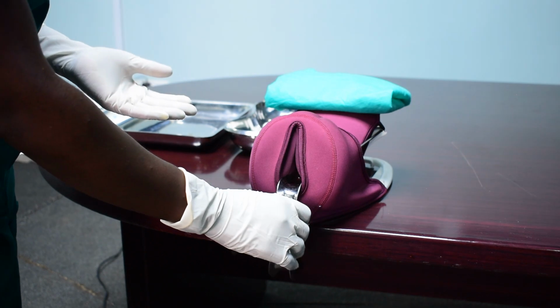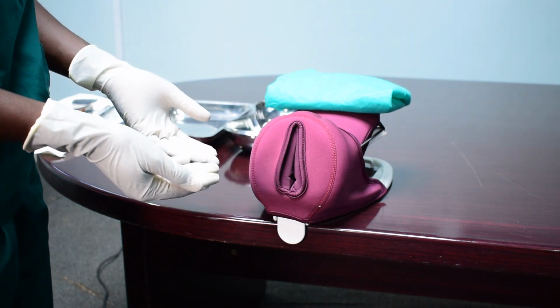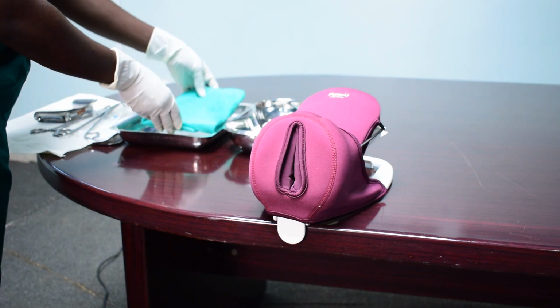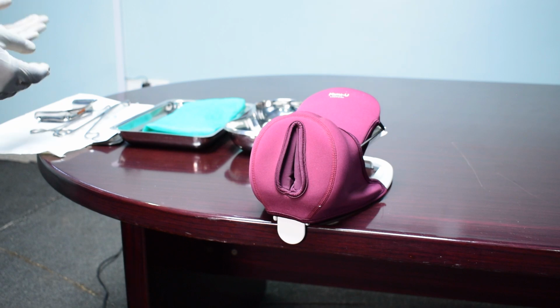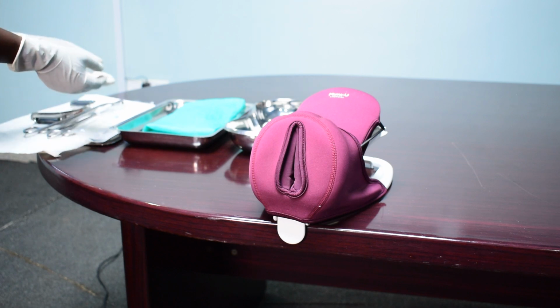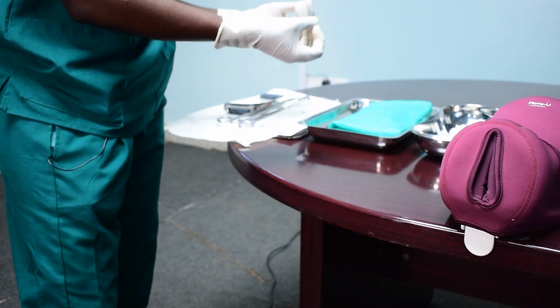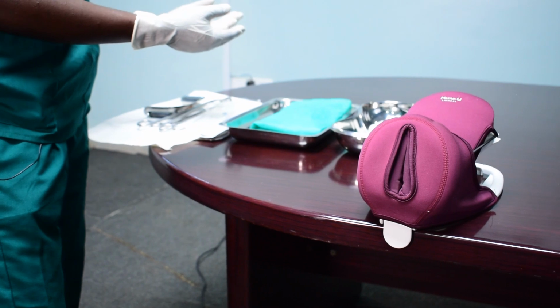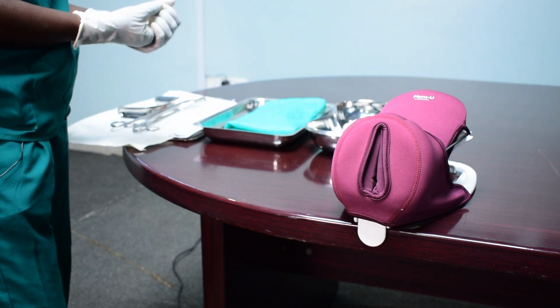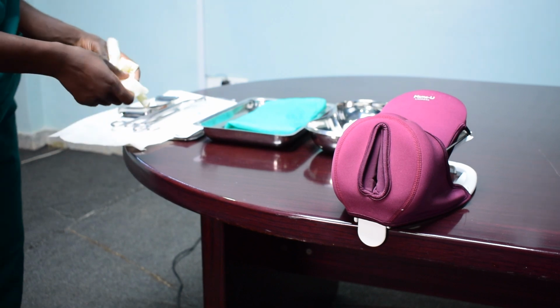So then we can remove our Sims speculum, and we will clean the mother, and we can remove this towel that we had placed for sterility. And then, having finished the procedure, we will make sure we collect all these instruments that we had used and we discard them in 0.5% chlorine solution for decontamination. And also we want to ensure that we dispose of other wastes appropriately. We know which goes to the non-infectious bin, which goes to the infectious bin, and which goes to the highly infectious bin. And then after that, I am going to remove my gloves and then perform hand hygiene.